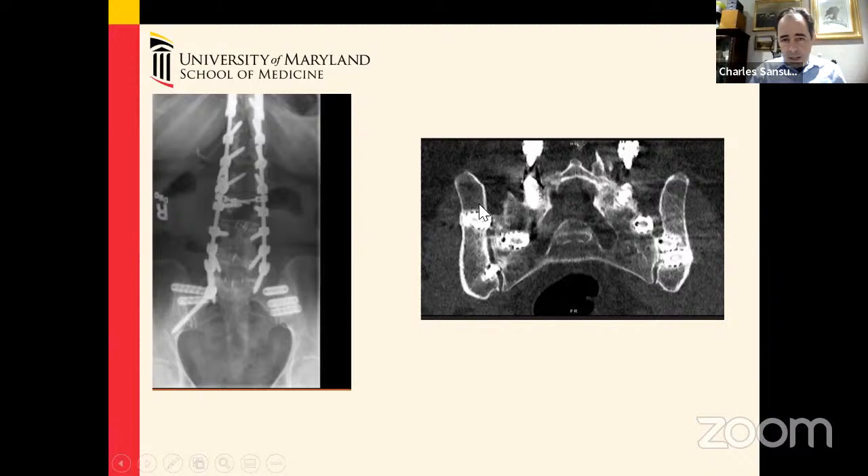You can appreciate a little bit of a halo around these screws, indicative of persistent motion, and there is no bridging of bone adjacent to the screws — indicating that this was a non-union. This CT scan was taken well over two to three years after these screws were placed, and this was all done in stages.